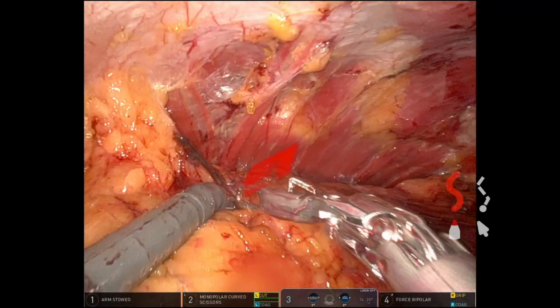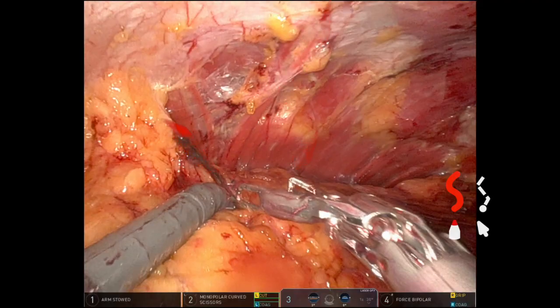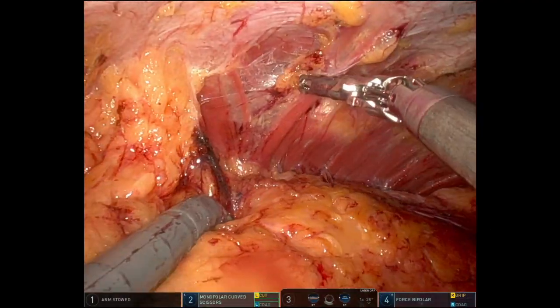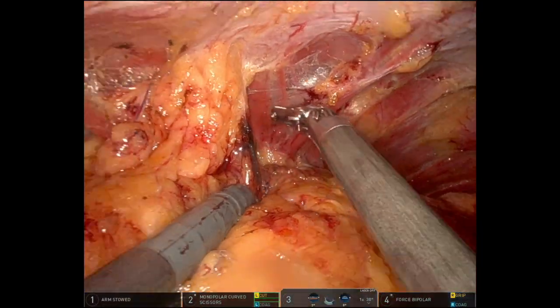Here I'm showing the fibers of the diaphragm. You can see the costal belly going towards the transverse abdominis, and there's a belly towards the xiphoid process — that's probably the sternal portion of the diaphragm.